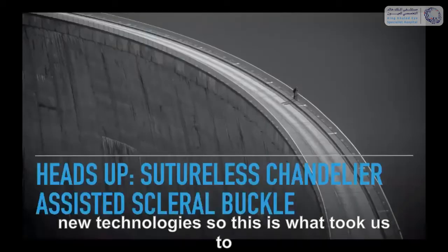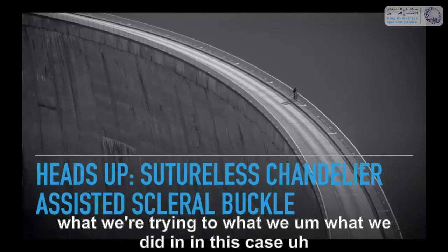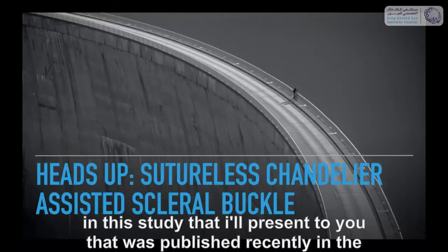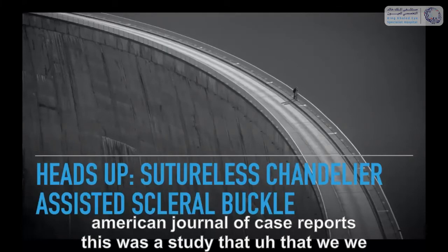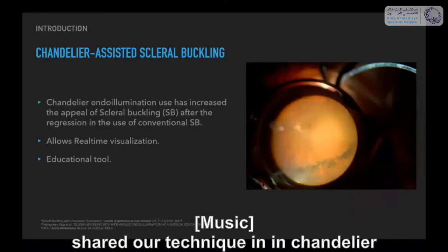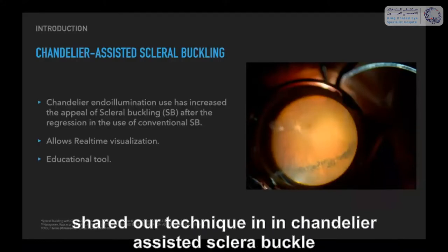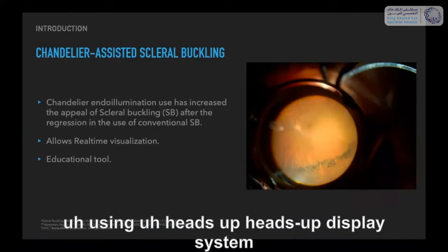So this is what took us to what we did in this study that I'll present to you, which was published recently in the American Journal of Case Reports. This was a study in which we shared our technique in chandelier-assisted scleral buckle using a heads-up display system.